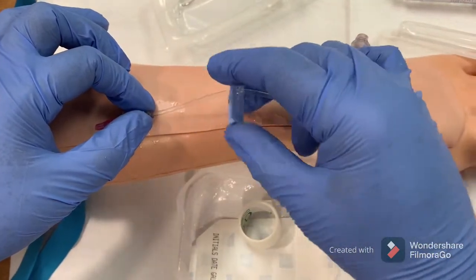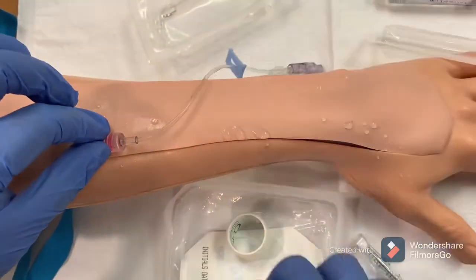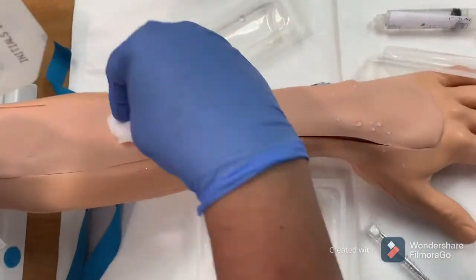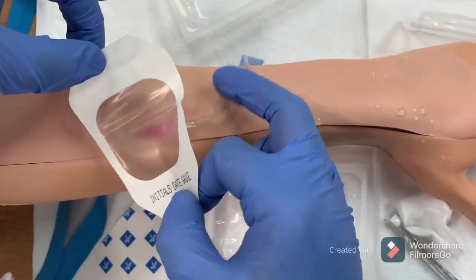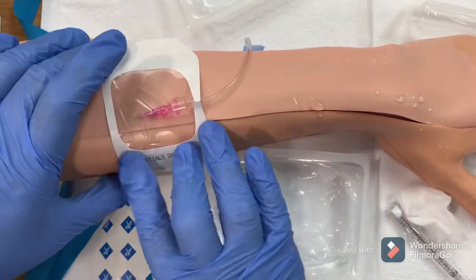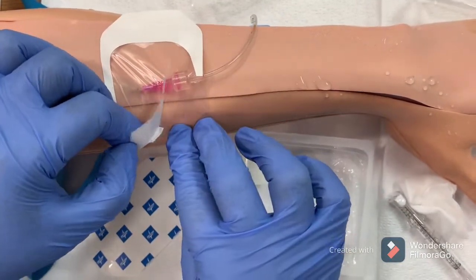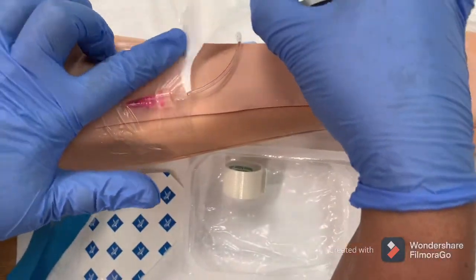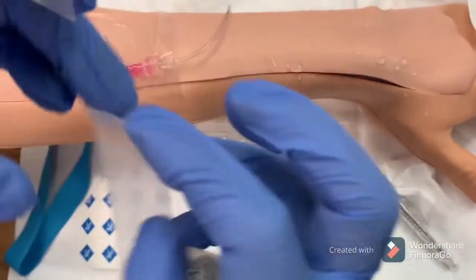Don't touch the tip of the extension tube. Apply the cap to keep it sterile and clamp the extension tube. Apply a sterile transparent dressing — normally we use Tegaderm. Make sure the dressing is properly attached to the skin with no air leak; make it tight.